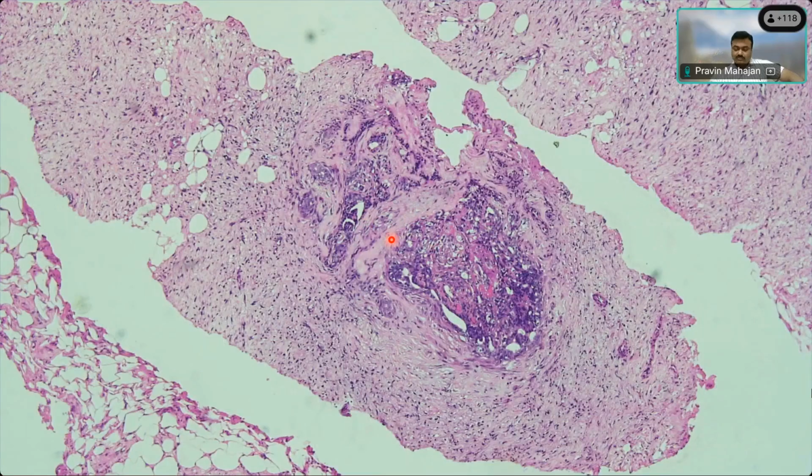Maybe it could be a... somebody said DCIS. It doesn't look like DCIS to me, because in DCIS you'll have very uniform cell morphology. This is not a uniform cell morphology. Then you'll have very nicely punched out areas, which are not there in this, to say a DCIS.